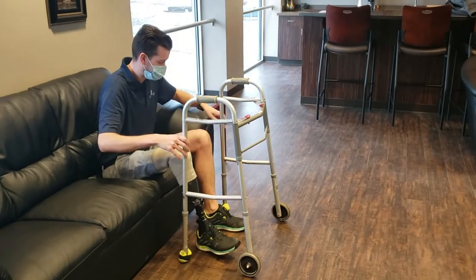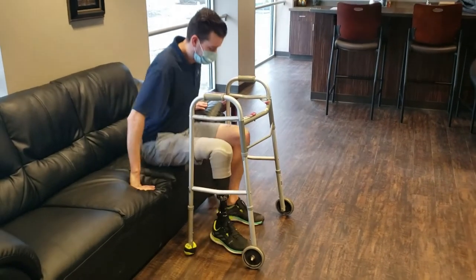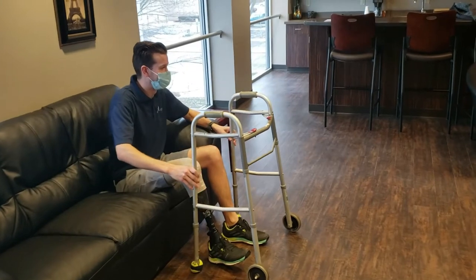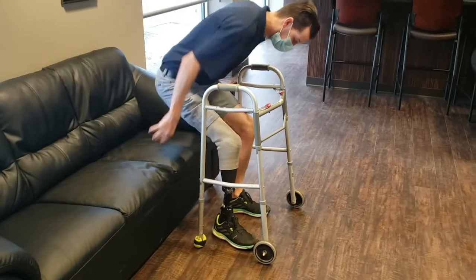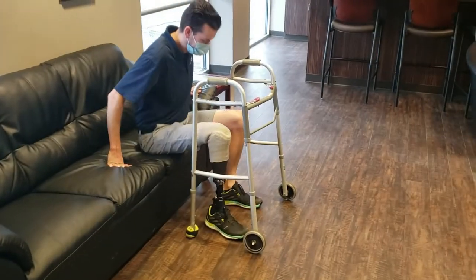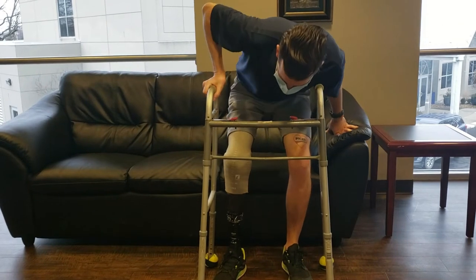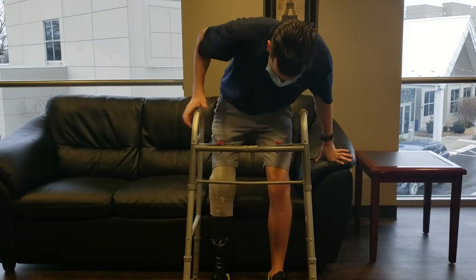Trying to get on and off a softer chair like a sofa is a lot harder. You'll see what Mark tries to do here — he scoots forward and adjusts the walker, but then he doesn't really make it all the way up because he doesn't have his feet in the best possible place. So now he leans forward, scoots out, and tucks that left foot under him a little bit more. When he sits back down, he reaches back for the arm of the sofa.